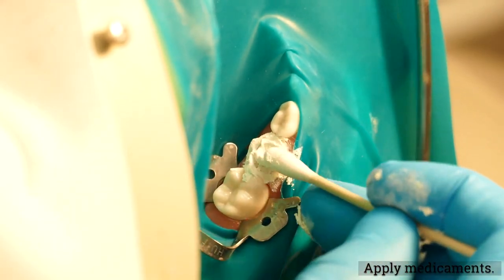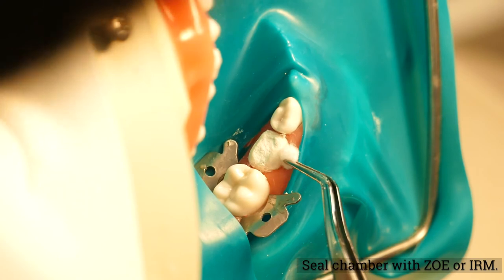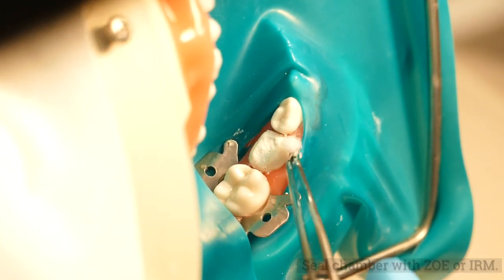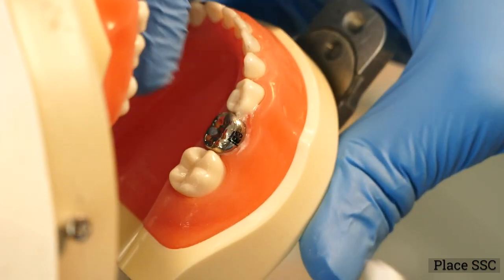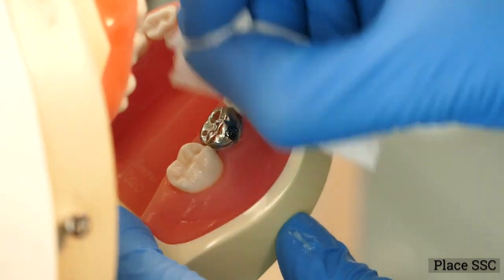Following hemostasis, apply the medicament of choice to pulp stumps per manufacturer's recommendations and fill with ZOE. Evaluate the preoperative occlusion. Place a stainless steel crown, which is the recommended sealing restoration.